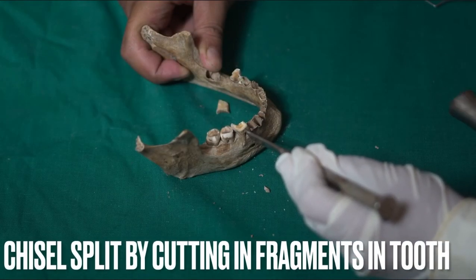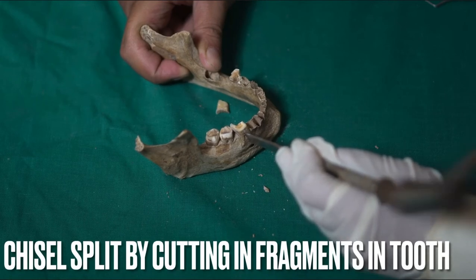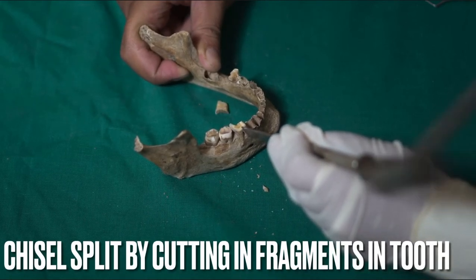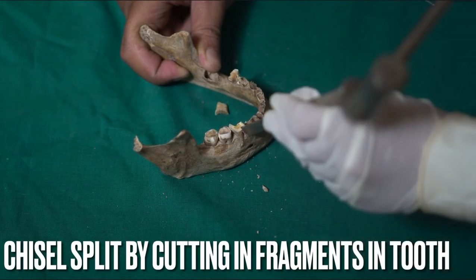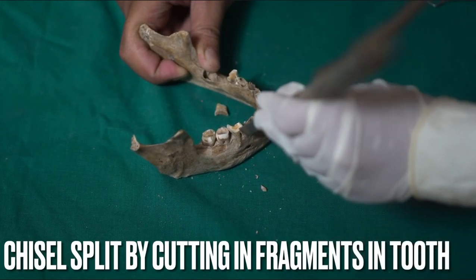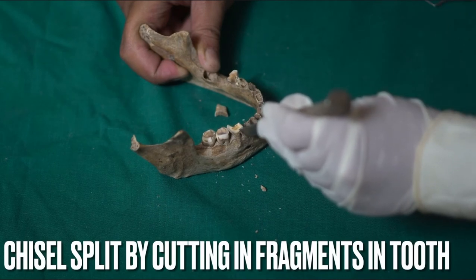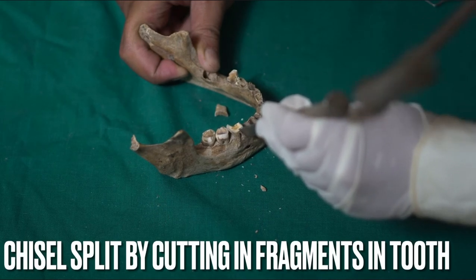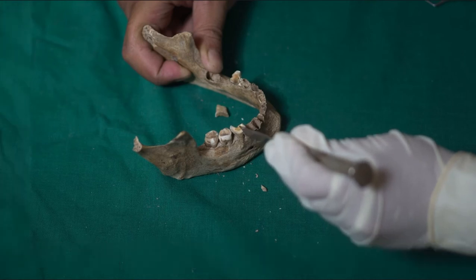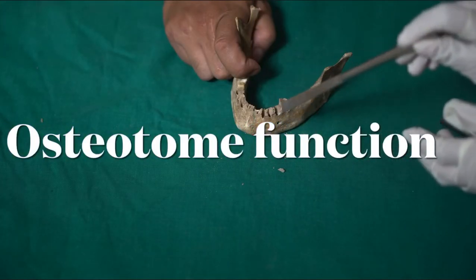You can also use the chisel to split the bone, but it does so by chipping — that is, in fragments. It does not split the bone or tooth as a whole. As shown in the video, when malleting on the buccal side, the chisel will cut only on the buccal side and not on the lingual side.